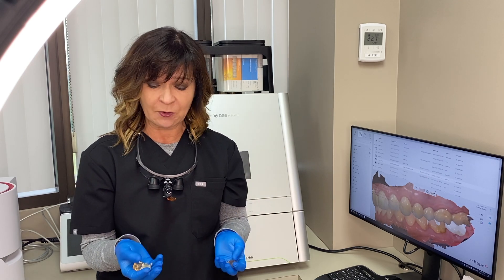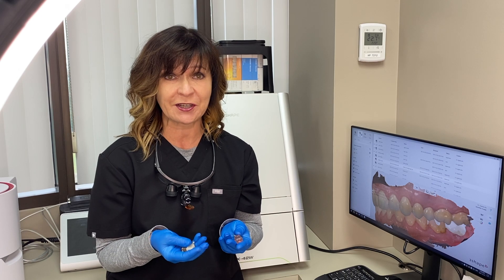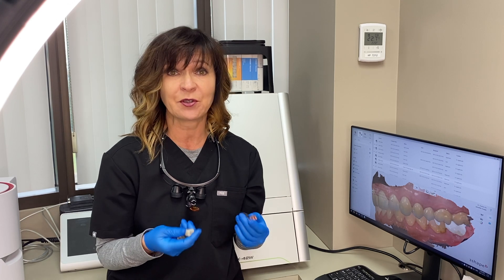Hi, I'm Dr. Agatha Viss. In this video, I'm going to quickly review the Vida Suprenity material for restorations and go over when and why I use it, and give you a couple of tips and tricks to making it a beautiful restoration.